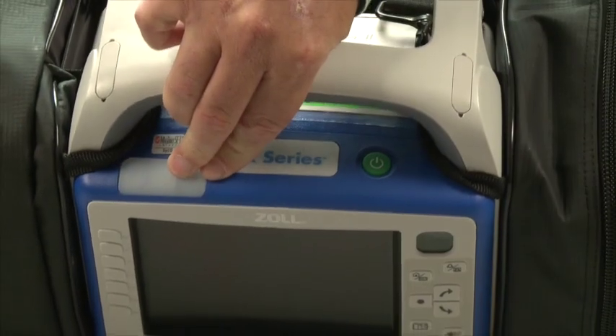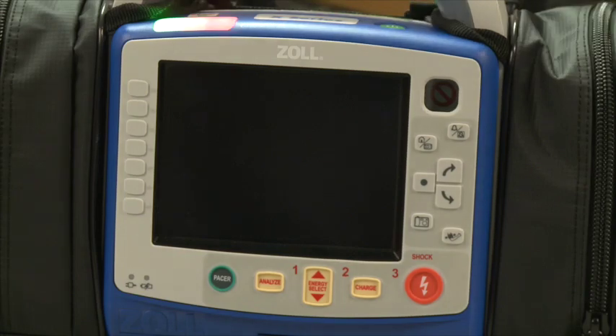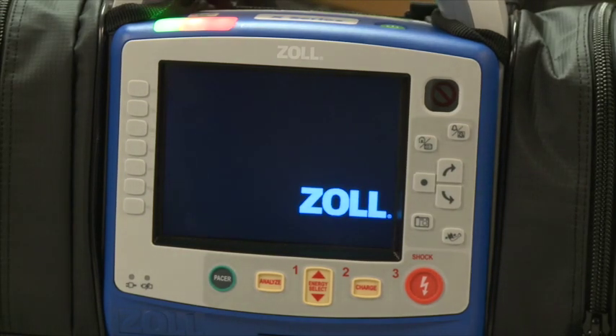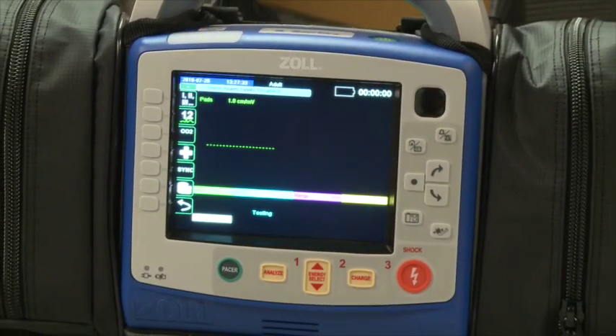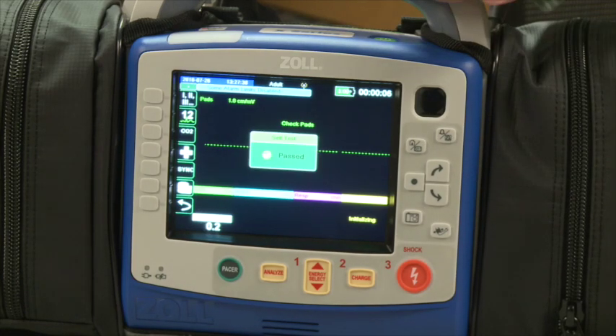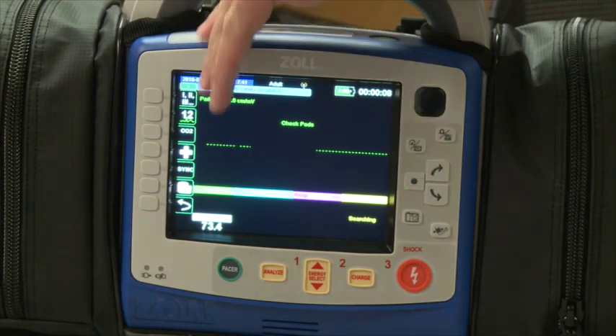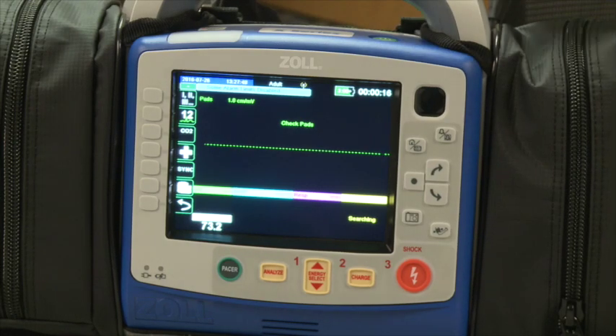The green power button on top turns the device on. It will do a self-test every time it's turned on — you'll see a series of lights come across the top of the screen as well as an inset box saying 'self-test passed.' Keep in mind these devices can be configured any way you want. If you'd like the screen to present differently or a different view, let one of the supervisors know and they can change that for you.